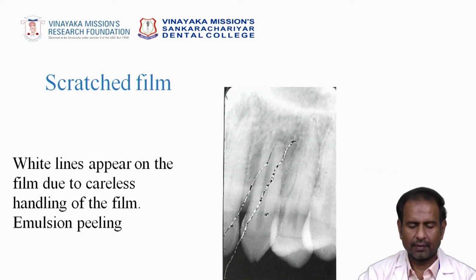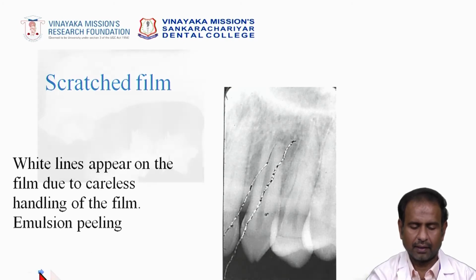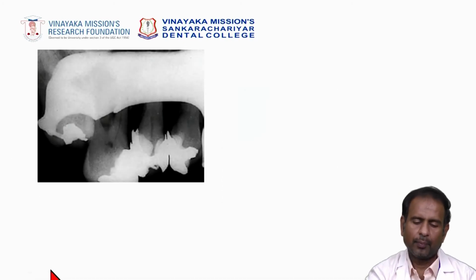So the handling of the film matters. Sometimes nail scratching causes emulsion peeling. That is called emulsion peeling due to the nail scratch. The film handling is very important. Be very careful.